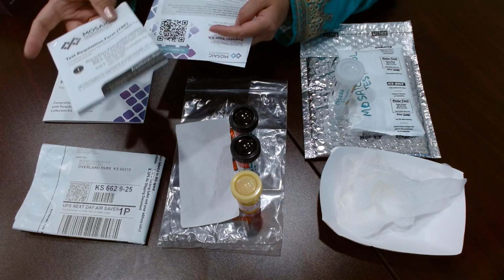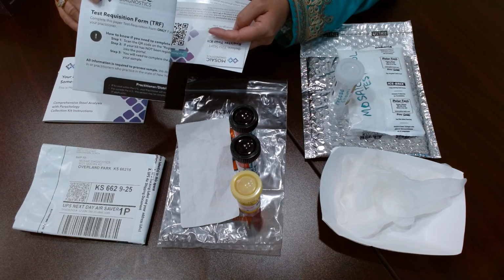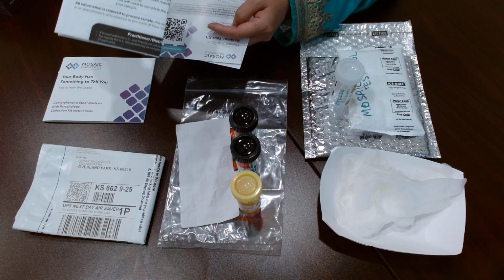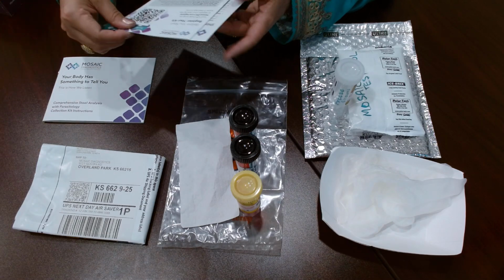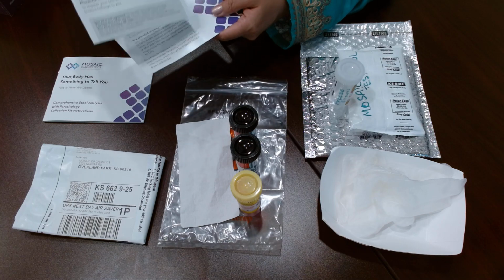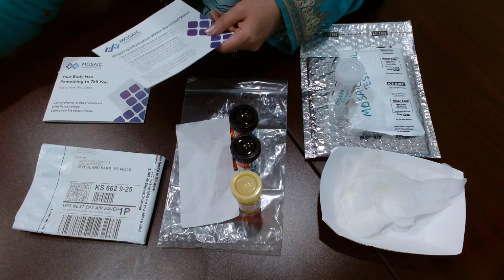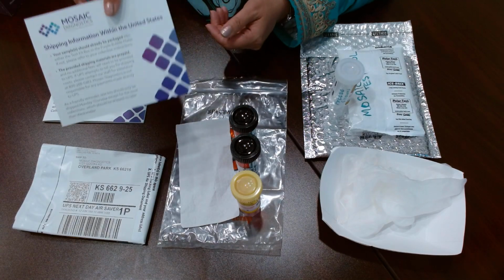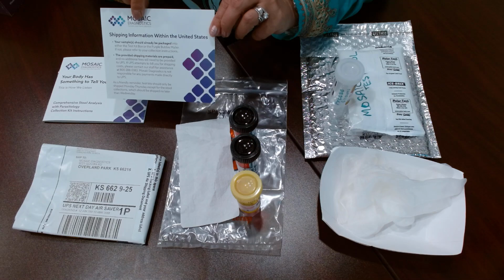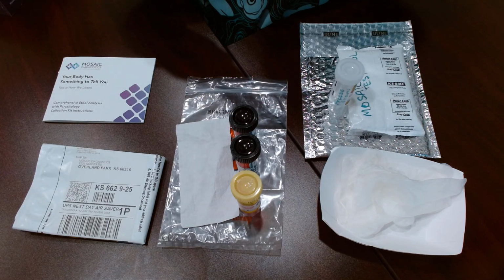Then they also have a paper requisition form, which will not be needed because we will fill it out for you electronically, so we'll just throw it away. And then of course, if we ship you something you would probably have to register, but this will also not be needed, so we will not give this to you. And this is just another card which tells you about the shipping information. So let's start talking about what the test is all about.